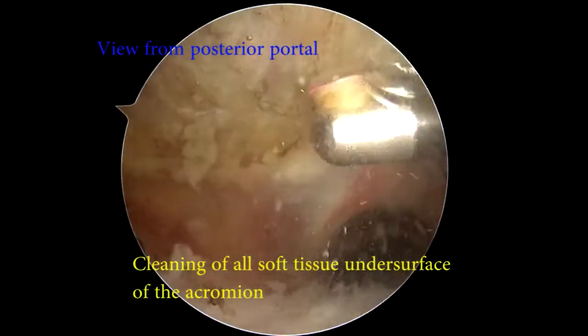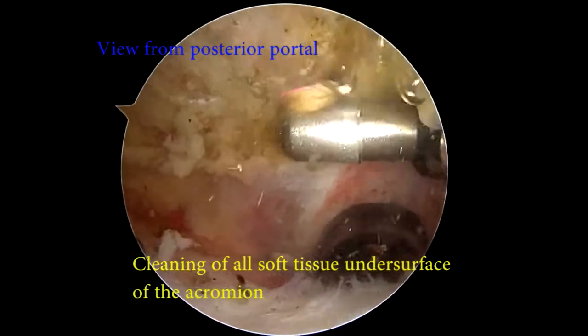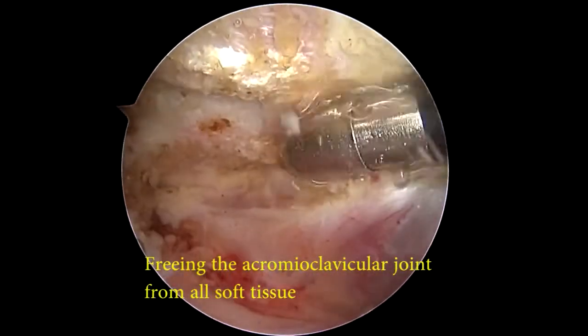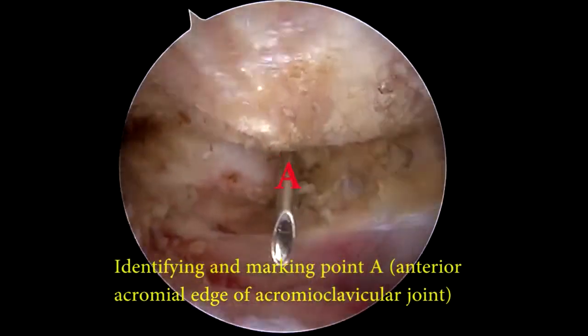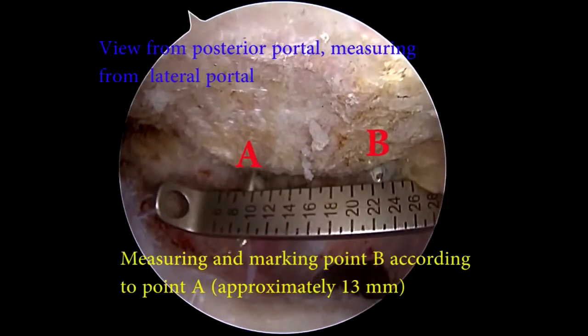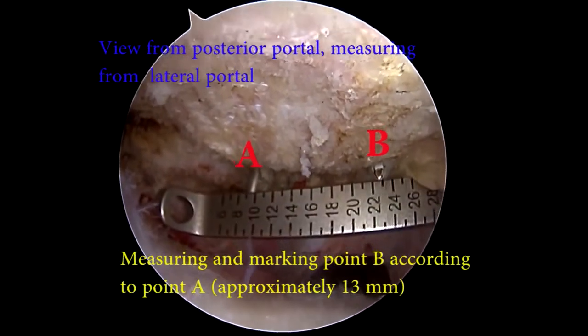During the operation, the 30 degrees arthroscope is inserted into the subacromial space via the posterior portal. After all soft tissue on the undersurface of the acromion and acromioclavicular joint is cleaned, the point A is identified and marked with a spinal needle. According to the preoperative planning, the point B is identified by measuring the distance of AB via the lateral portal and marked with a spinal needle.